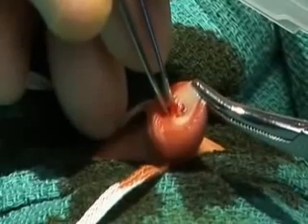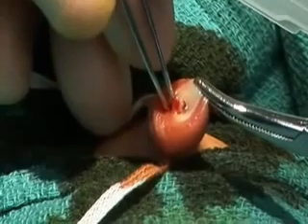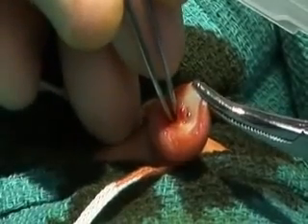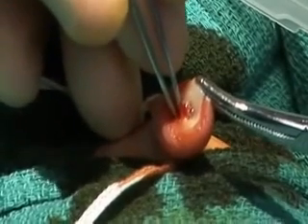To dilate the artery further, place the closed tip of the forceps back into the artery, insert to a depth of 1 centimeter, and allow the forceps to open slowly. Leave the forceps in an open position for 20 seconds to dilate the vessel completely.